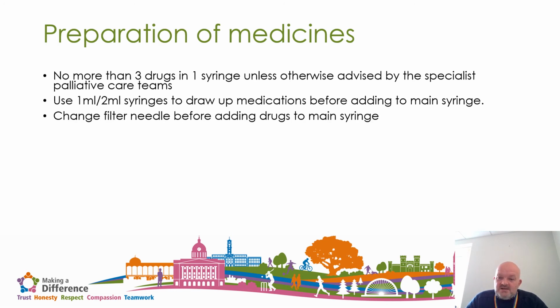When we're using a glass vial for the drug, we need to use a filter needle, because when you break off the lid of the vial, a microscopic piece of glass may get dropped into the actual drug, so we don't want that anywhere near the patient. By using a filter needle, we can make sure that when we're drawing up the drugs, if there are any shards, they go into the filter needle.